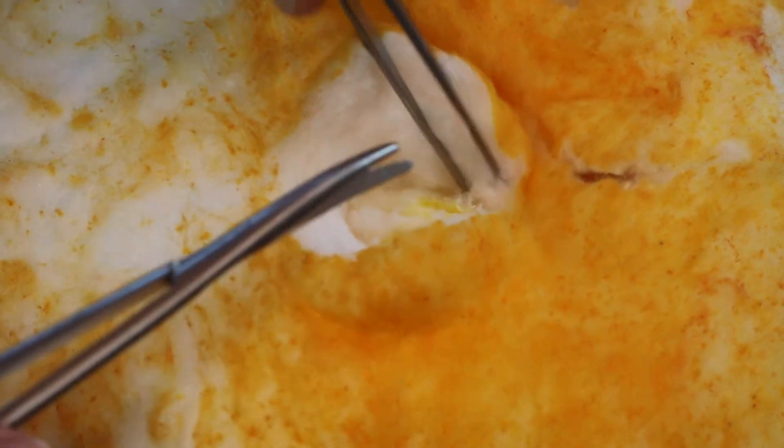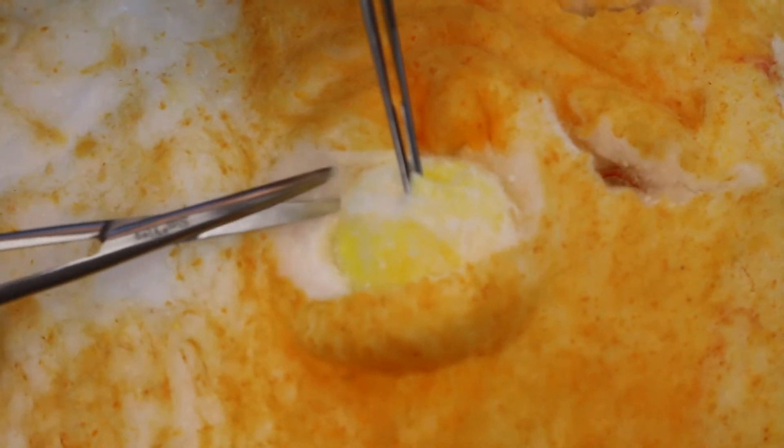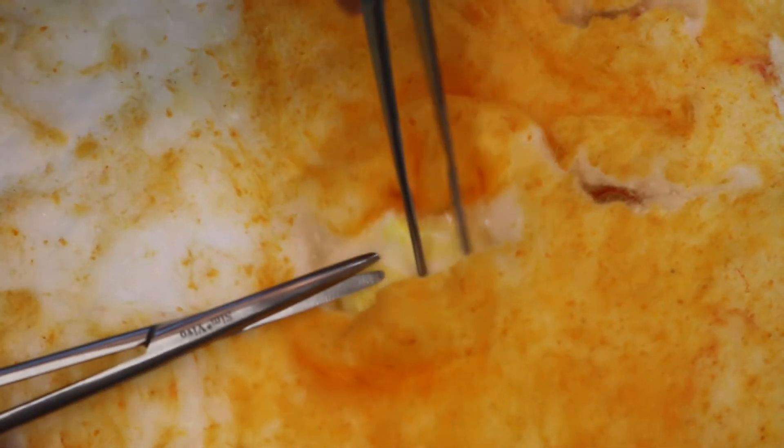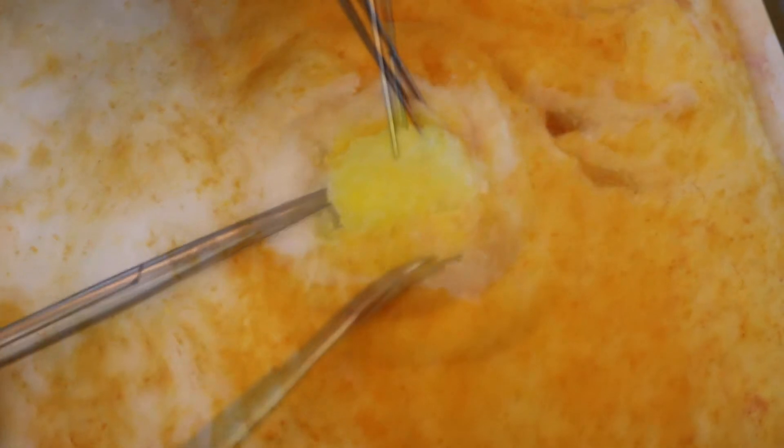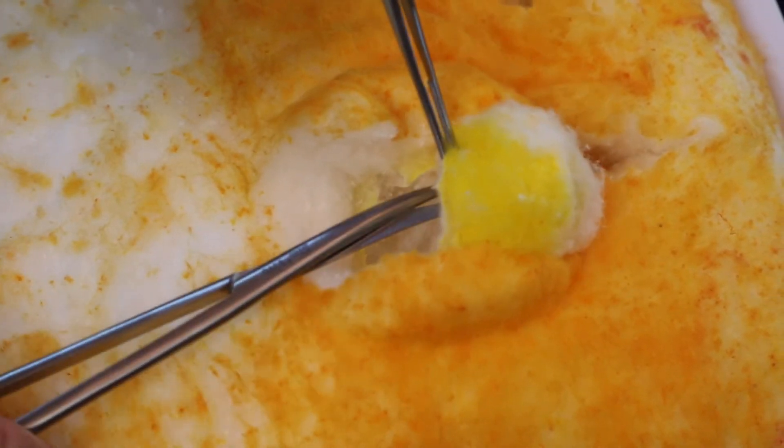The masses in the center are larger, however the technique is the same. It will be a little more difficult to develop the plane on the undersurface, but with appropriate retraction and careful cutting, this can be done fairly easily.